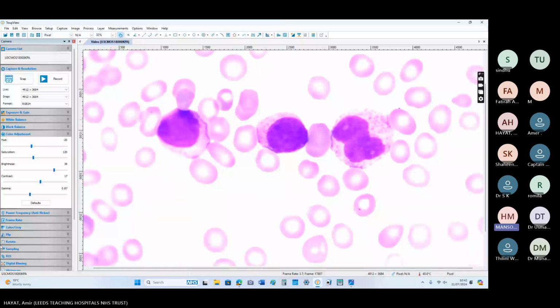There are many blast cells as well, which have a high nuclear to cytoplasmic ratio, with a copious amount of cytoplasm as well, containing granules. Findings are consistent with acute leukemia. Features favor acute promyelocytic leukemia. I would advise urgent flow cytometry, translocation 15;17, and DIC analysis, and an urgent referral to hematology assessment unit.